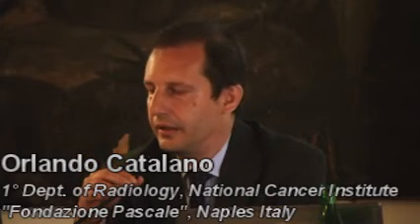Otherwise, the oncologist feels the risk of a malpractice issue. If we talk about CEUS, I have to say that most of the oncologists in my institution have learned the correct use of this imaging modality, and we have their trust, and in most cases they will rely on our diagnosis.